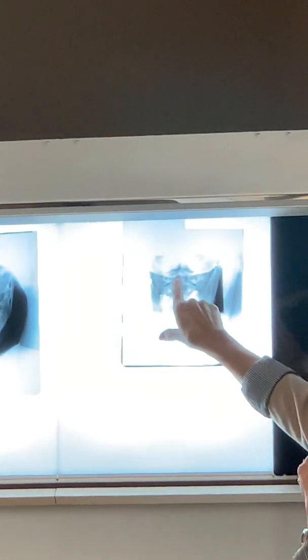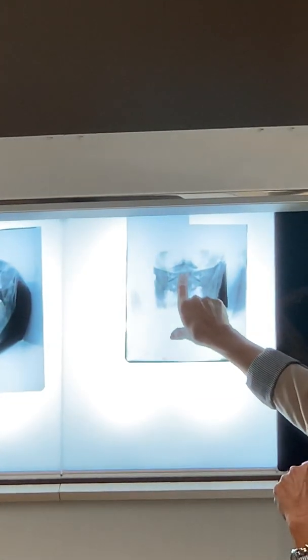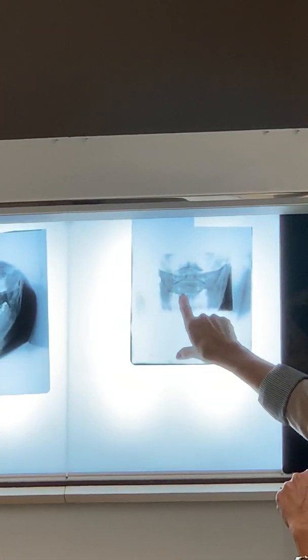What about this one? Lower. Why did you say lower the chin? Because the occipital bone kind of hits the top of it. Good. This is the occipital bone coming around here, so it's hitting the top. This one definitely needs to be repeated. So we're hitting the top of the odontoid process.